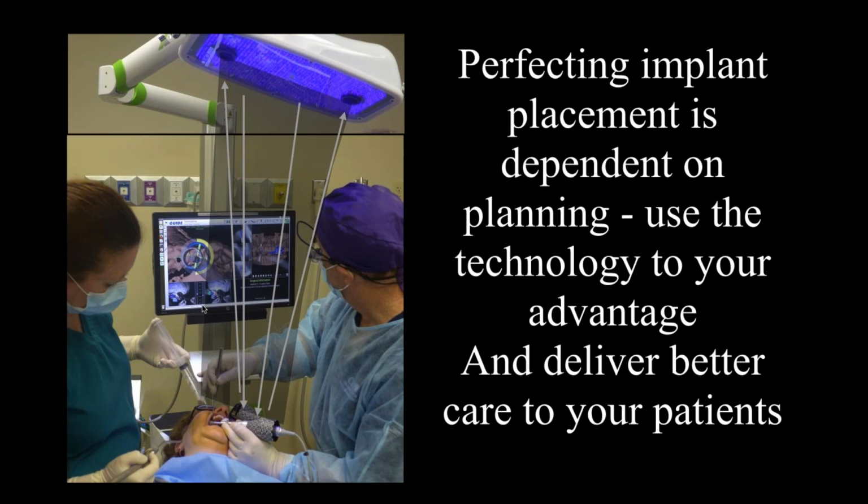Now, it's always important to get someone to photograph yourself because you might be surprised what you see. Look at my neck, not very good. So now I'm moving the system. I'm moving this over to where she is almost, to that area here. So now I'm squaring my shoulders. And just by having somebody take a picture, I'm learning how to stand and work a little better for my back and my neck. And so I'm standing straight up when I'm doing this. You can sit down and do these. It's just very easy to use these systems.